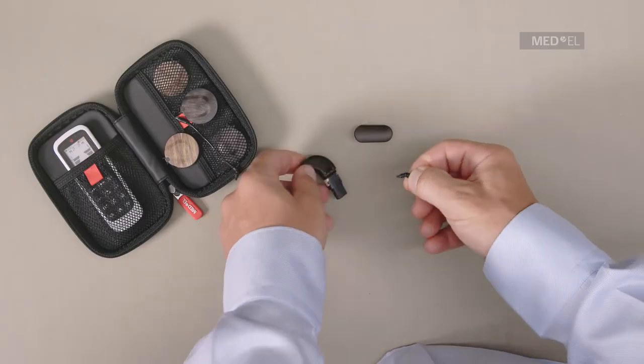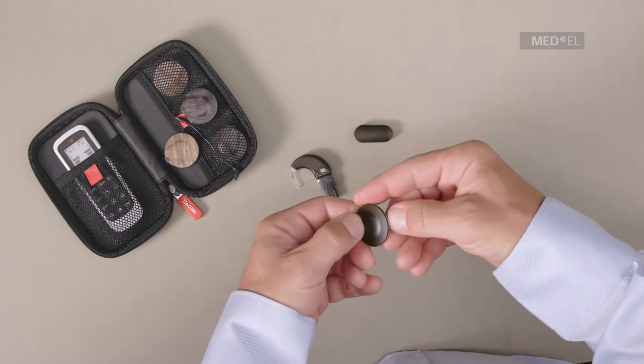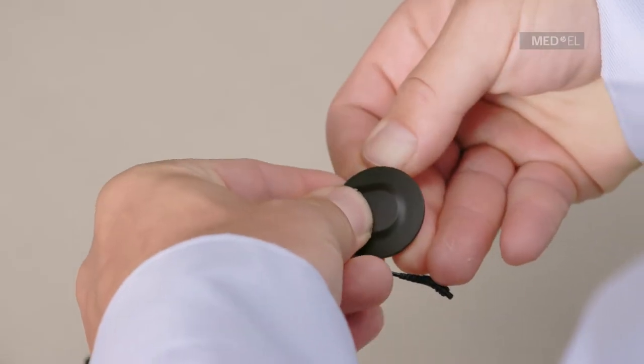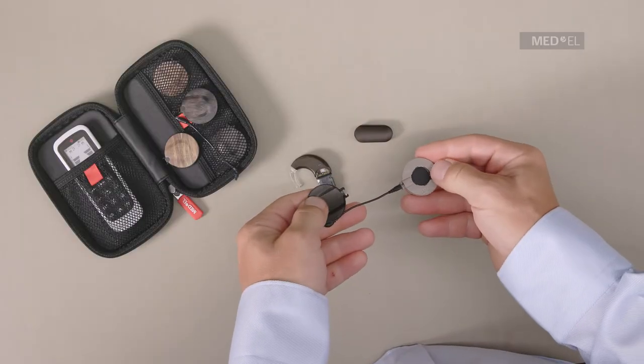To detach the cable from the coil, first remove the coil cover. Insert your fingernail into the small groove between the coil cover and base and slide around the base to gently detach it.